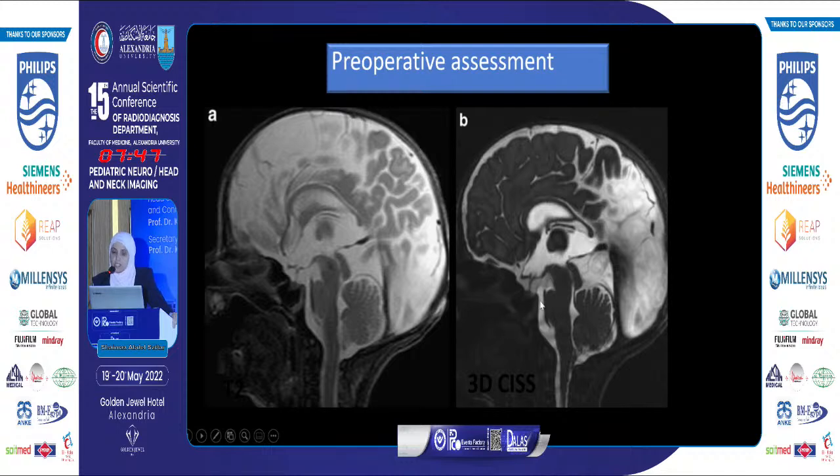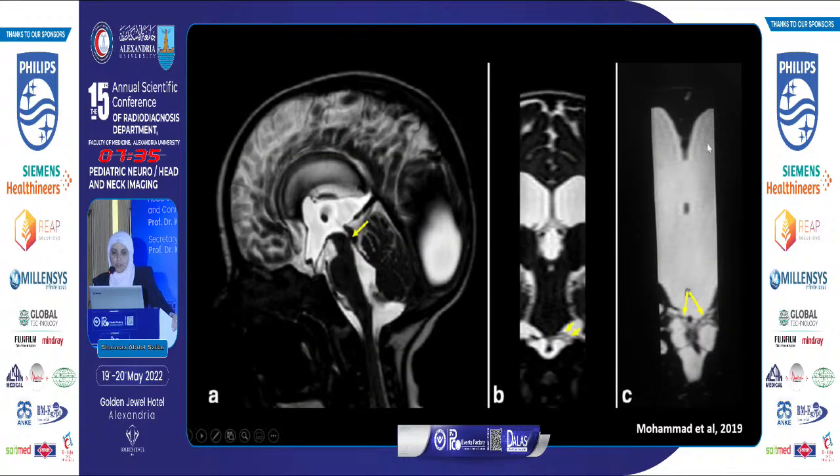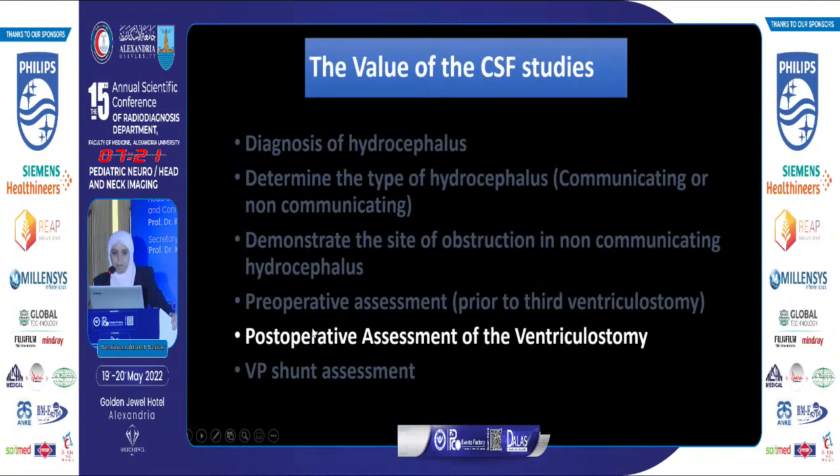When the surgeon knows that there is a Liliequist membrane, he should manage the case according to its presence by endoscope. Also, with these prepontine adhesions, the surgeon can judge if this is a candidate for endoscopic third ventriculostomy, or this patient is going to fail if the ventriculostomy is performed.